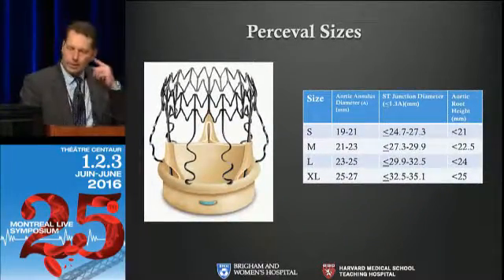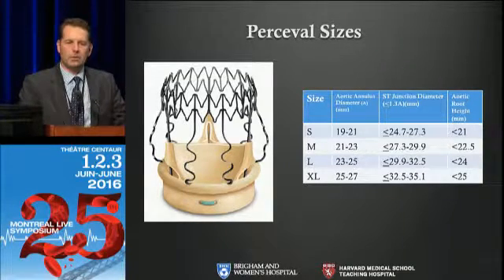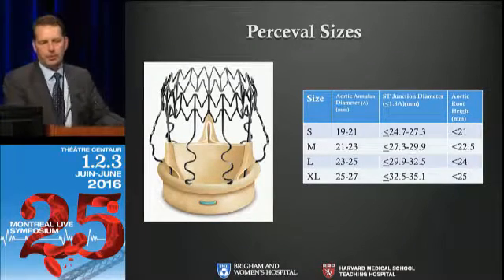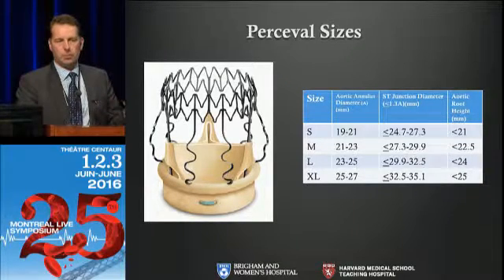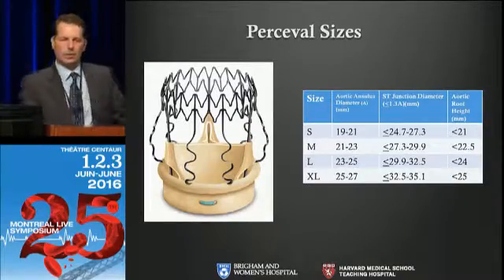So it's based on a nitinol frame, with bovine pericardial leaflet tissue. It comes now in 4 sizes, and perhaps a double XL will be available. I'd estimate about 10% of patients, once you debride the valve, have an annulus that is really too big to implant any of these valves unless you start plicating the annulus or something like that.